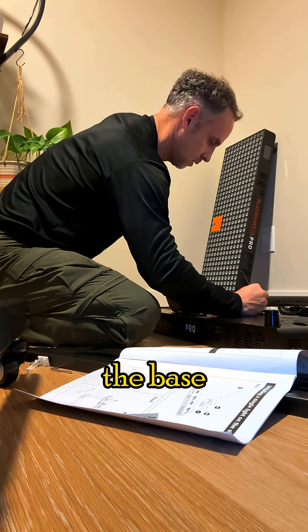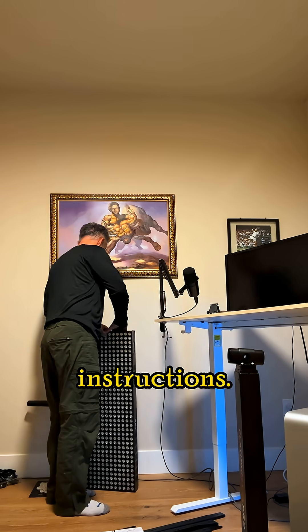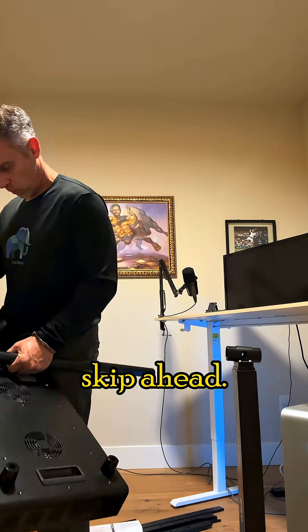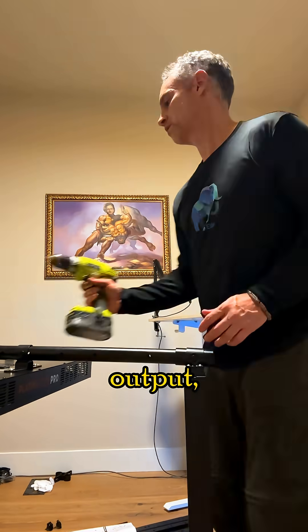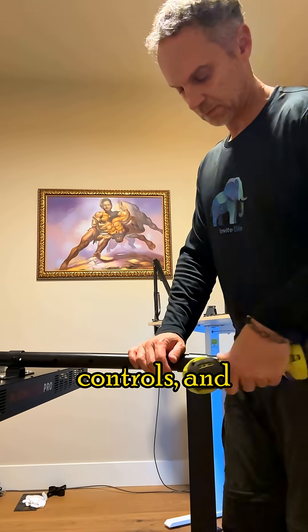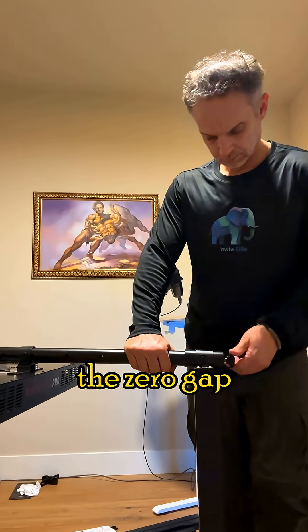It's important to assemble the base according to the instructions — don't try to skip ahead. I wanted to get these panels assembled ASAP. The features include 50% increased light energy output, individual wavelength controls, and the zero-gap design.